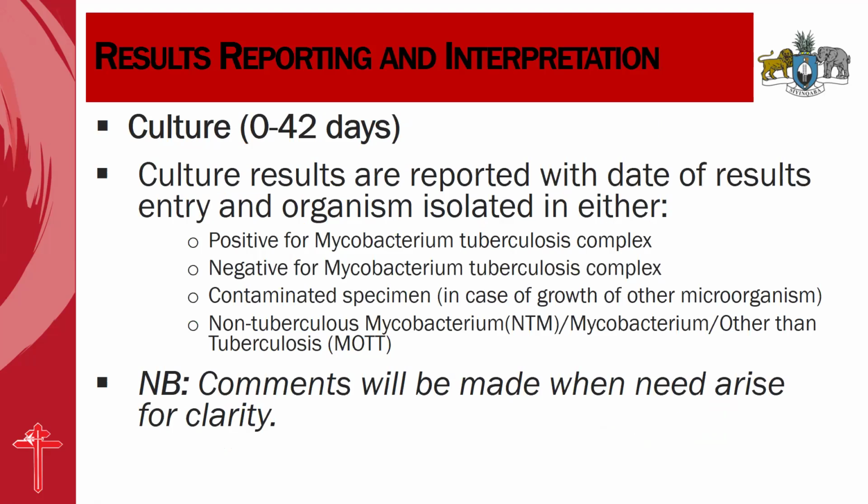So for culture, the TAT is 0 to 42 days. Culture results are reported with date of result entry and organism isolated, either positive for Mycobacterium tuberculosis complex or negative for Mycobacterium tuberculosis complex. And sometimes it can be contaminated, so we can have a result of contaminated specimen.